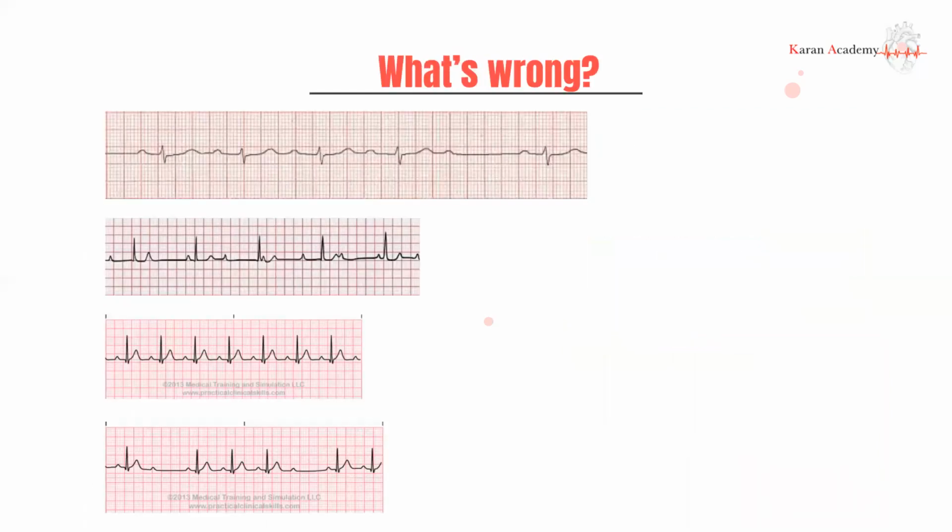All right, so what's going on here? Identify the heart block. We have prolongation, a bit more prolongation, a bit more, then drop. What is that? That's going to be your Mobitz type 1, or second degree AV nodal block type 1. What is this? Now, long, super short, missing, long, it's completely disorganized. And this is your third degree heart block.